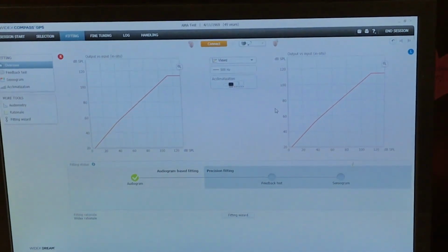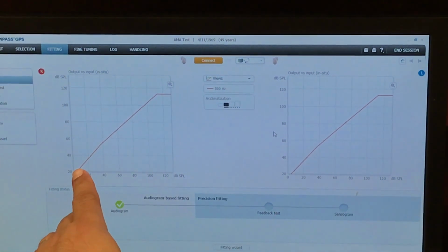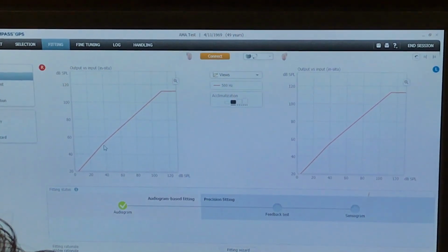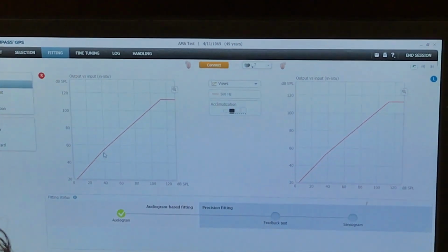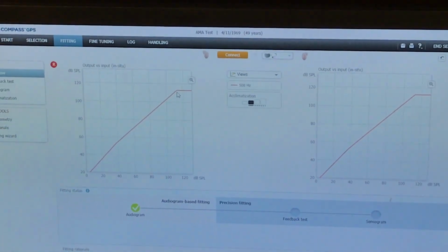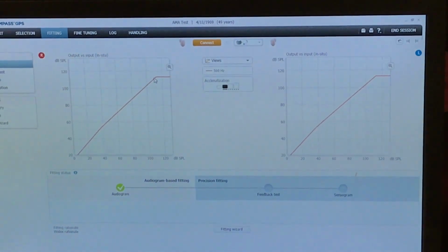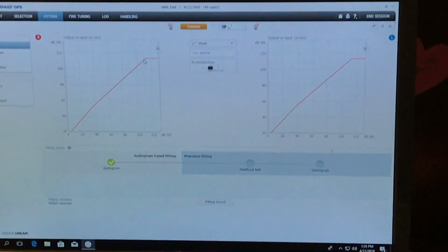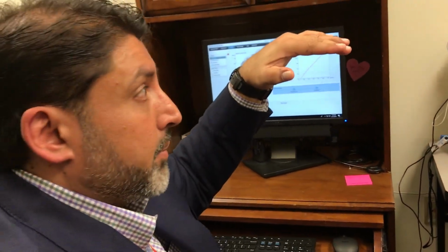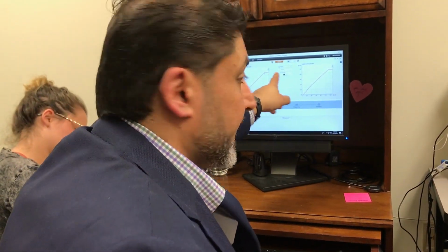Okay? So if I look at this device, I'm at 500 hertz, okay? You'll notice it's linear up until about what, 30, let me get my little mouse here. Like 38-ish. It's about, let's call it 38, good guess, okay? Then you'll notice I have output limiting at 112. So all hearing aids, if it's AGC, you have 2 kinds of compression. You have AGC compression, and then when you get to the UCL, it automatically output limits. If you have a true AGCO, you only have the AGCO.